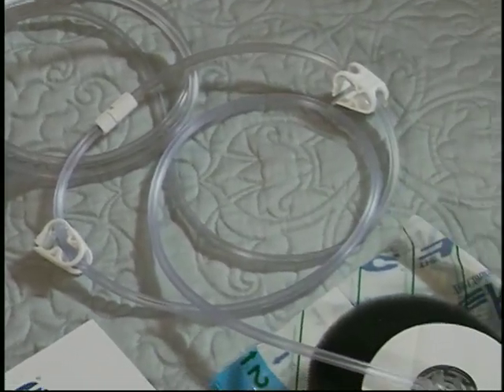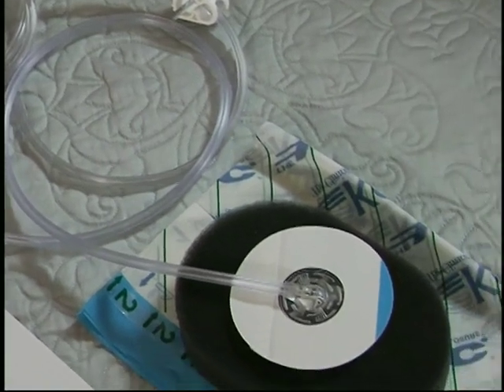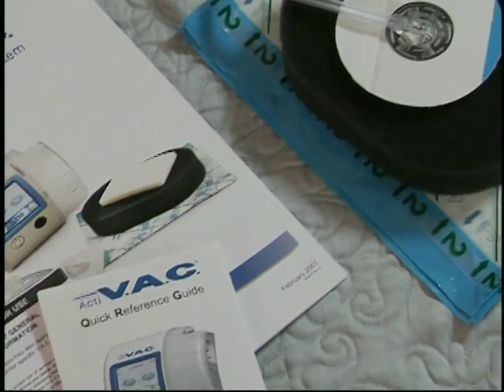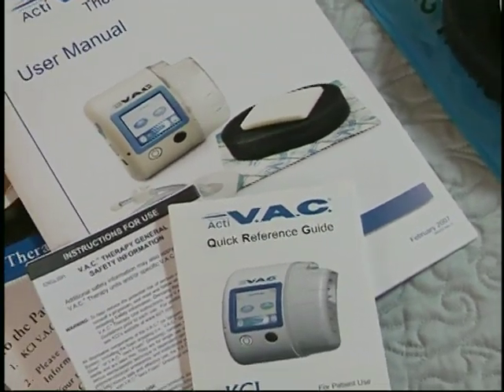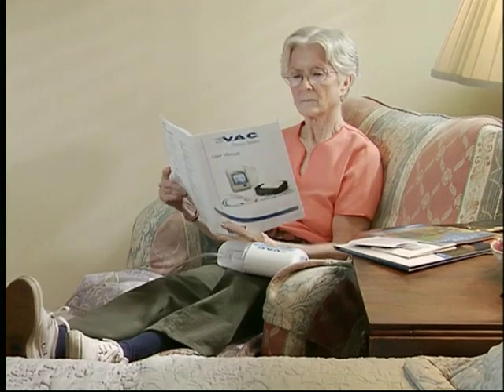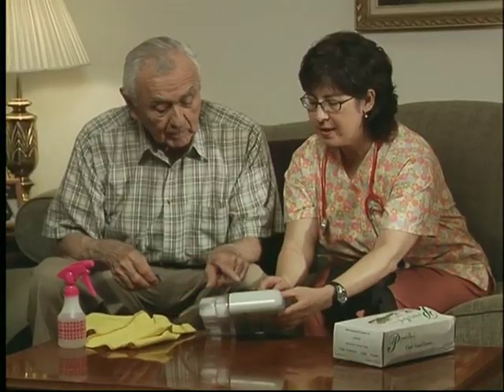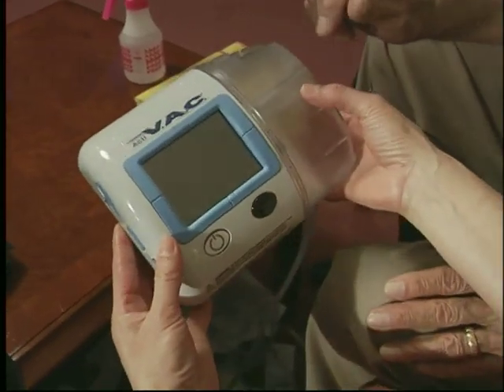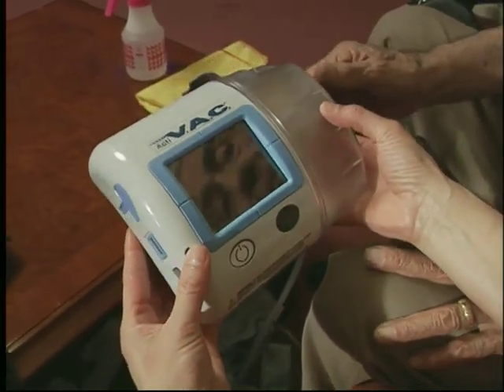ACTIVAC Therapy works by creating a negative pressure environment, helping your wound close. It brings the edges of the wound together as it removes infectious materials and other fluids. Today, we'll visit two patients who benefit from VAC Therapy and see first-hand the ACTIVAC Therapy unit and its components. We'll show you how it works and how to operate it throughout your recovery process.